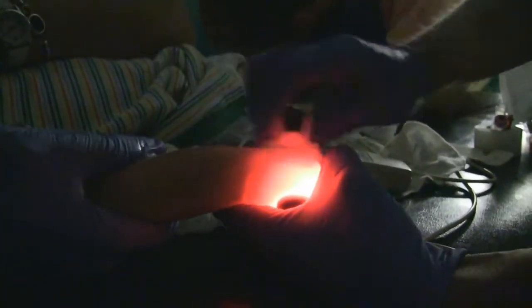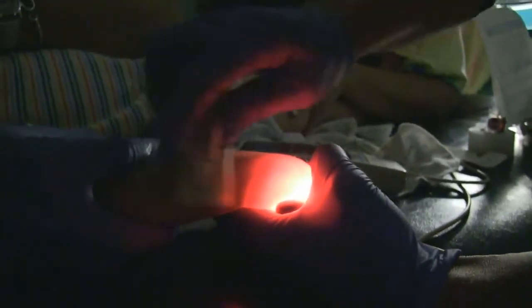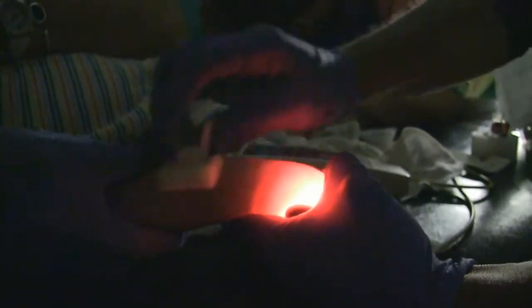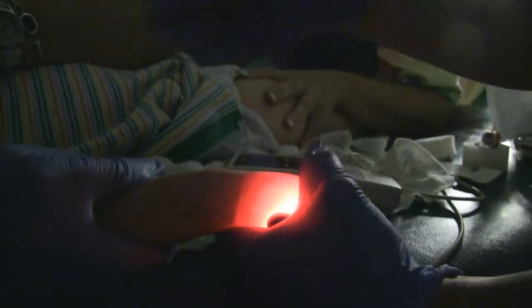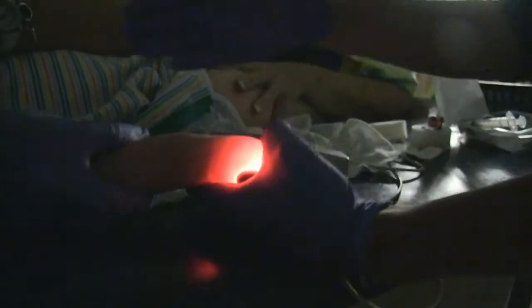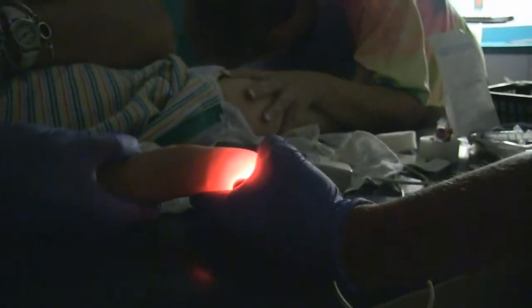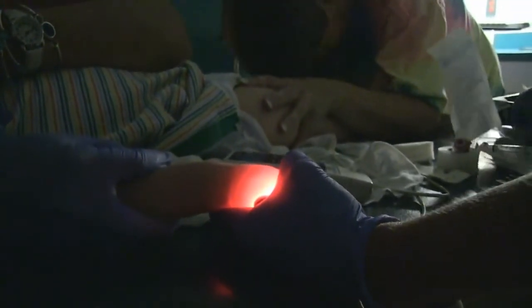Now, do you keep the light on when you put the IV in? I do. I hold it just right behind the hand with this hand, and then I'll use my other hand to stick. Sometimes I get somebody to turn the light on once I see a flash.